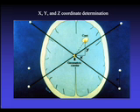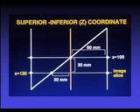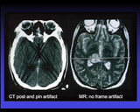When coordinates are determined using a Cartesian system, the frame center is identified, and the absolute distance into the brain, both left-right for the x-coordinate, anterior-posterior for the y-coordinate, and superior-inferior for the z-coordinate, is measured. The z-coordinate is determined by the presence of the middle fiducial. One measures the distance from the posterior fiducial to the middle fiducial, and generally adds 40 to that number in the Leksell system for the final z-coordinate. It is important to know how each frame system identifies and determines coordinates.